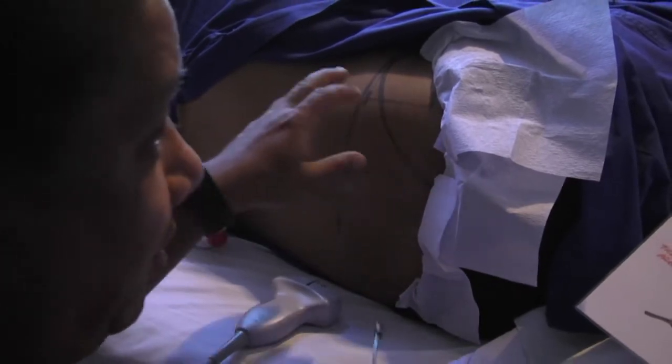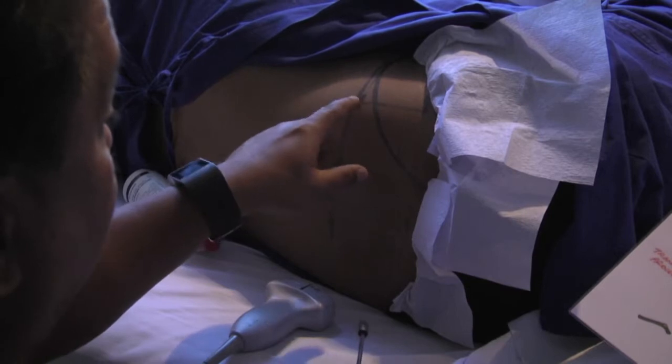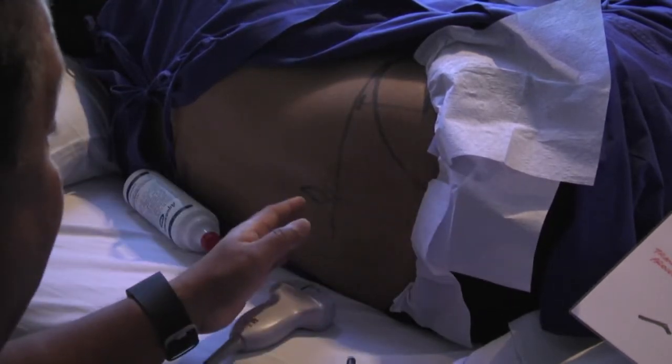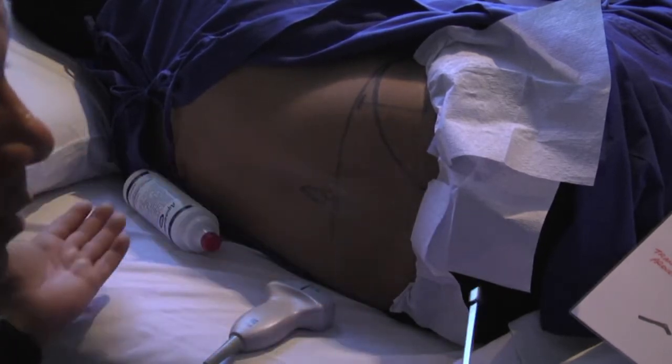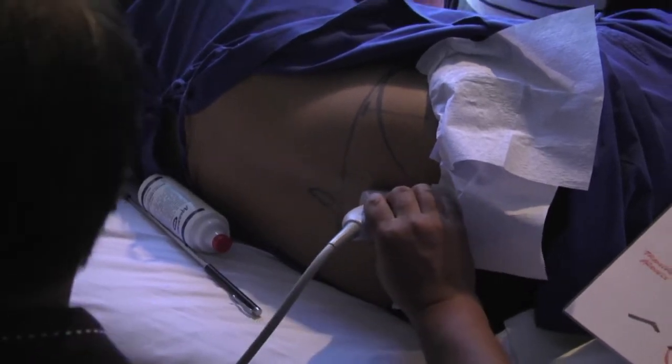So I told you a simple tip for the midline, but I don't recommend you put too many marks. So it's better to just put a mark away so that you can join it, and when you are scrubbing him, just leave that area. As long as you know that between these 2 lines, I'm looking at 3, 4, 5, okay? Right, so let's do that again.